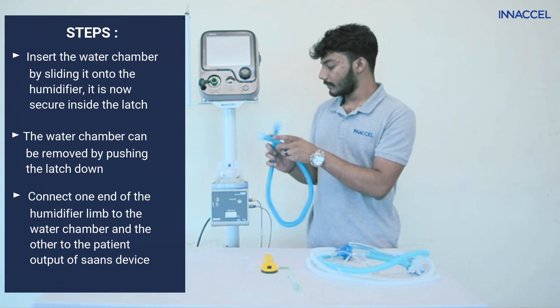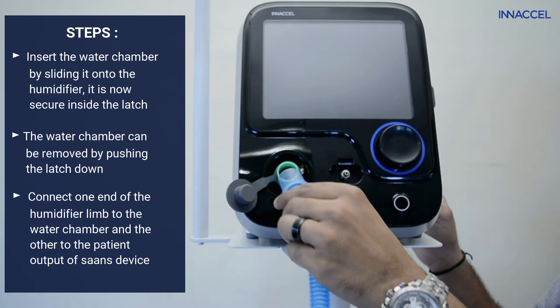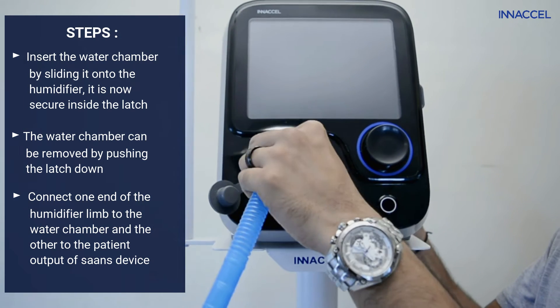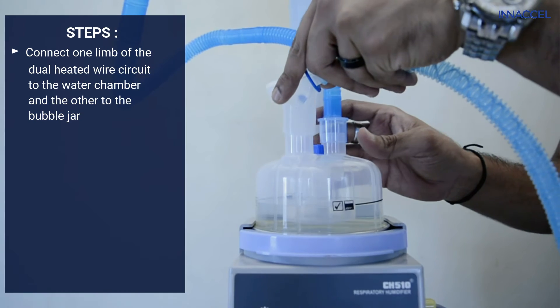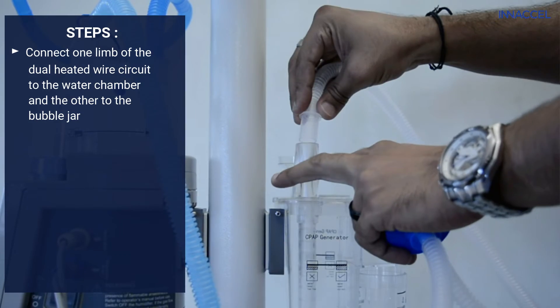Connect one end of the humidifier limb to the water chamber and the other to the patient output of the SAS device. Then connect one limb of the dual heated wire circuit to the water chamber and the other to the bubble jar.